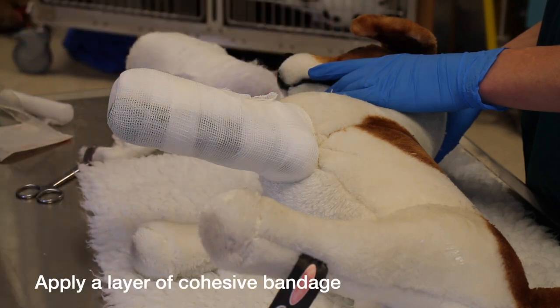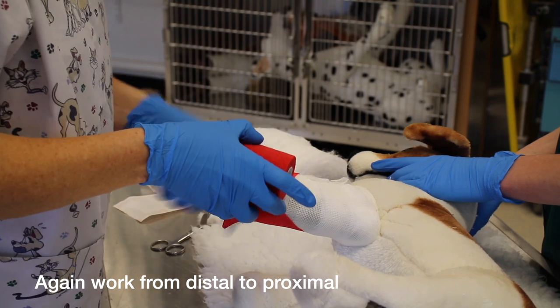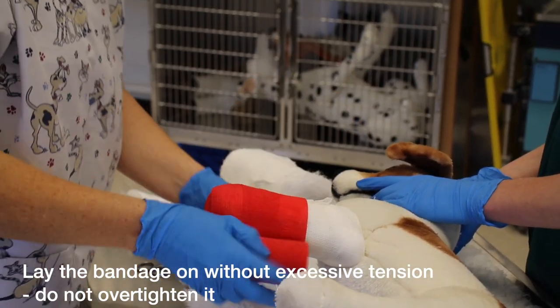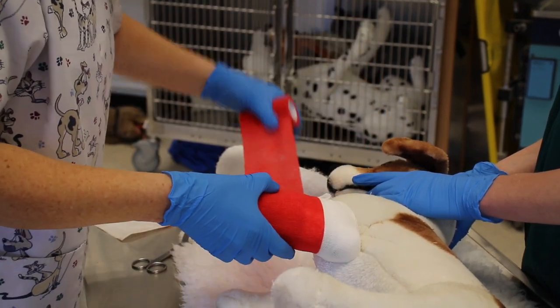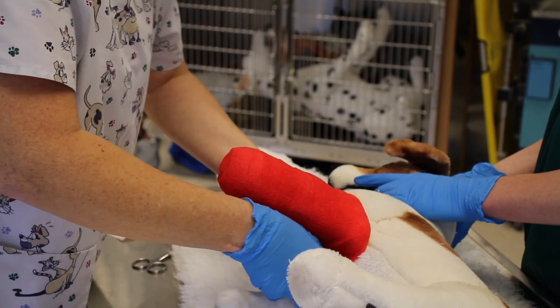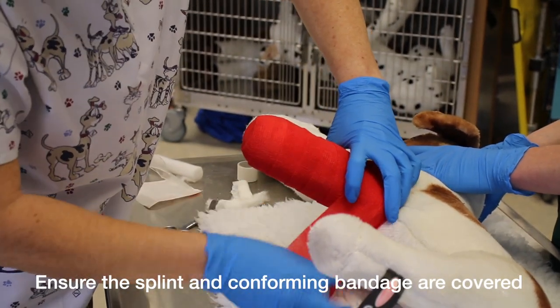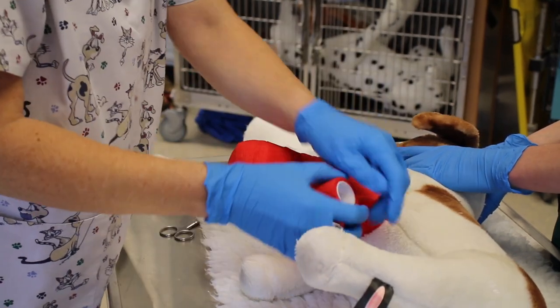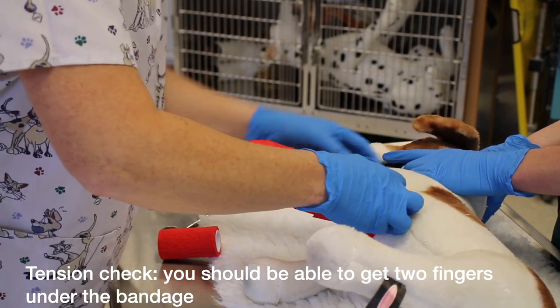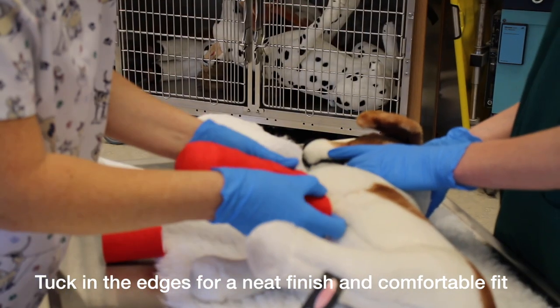And then finally our protective layer. Same principle — just make sure your bandage isn't going on too tight. Roll out a little bit and then place it around the leg, right up and over the edge of your splint, so you don't want to see any pieces of padding when you're finished. Remove the excess, check your tension — you should be easily able to get two fingers in there — and then tuck in on your edges and check there's no sharp edge on your splint. Tension's fine.